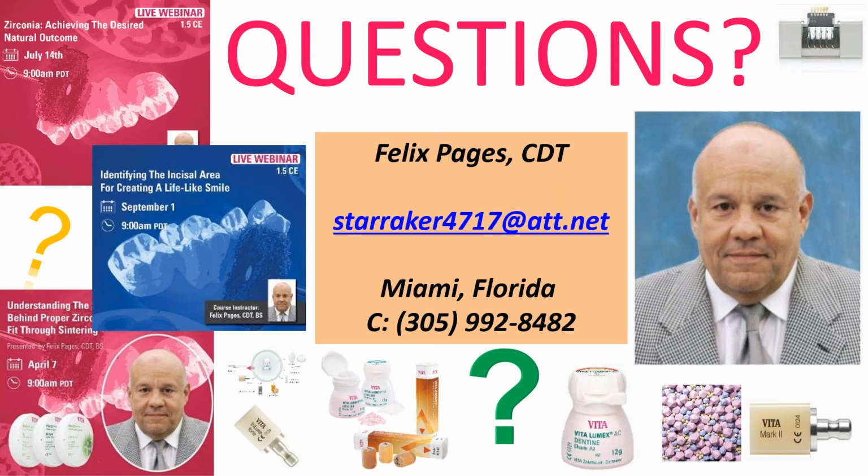And then when I put the bonding bake on it, I can use any color that I have in the Lumex kit or the VM9 kit to paint over that area to make it look like what the final shade is going to be. If it's in the incisal area, I've used the opal material, the bluish, or a violet stain, set the stain, and then build it up.